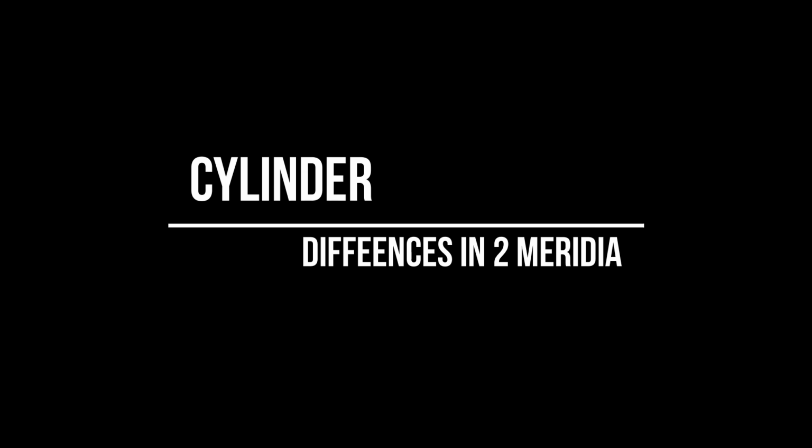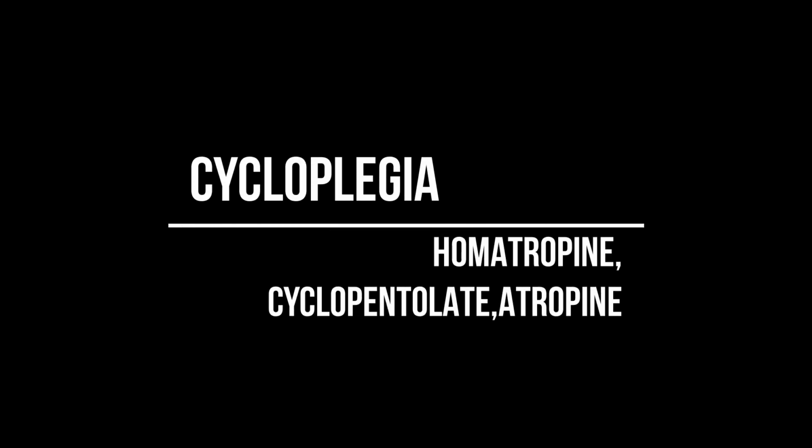Before you make your final calculation, be sure to have recorded all your findings in each meridian. For spherical correction, there is no calculation except for the working distance. Whenever there is a difference in power in two principal meridians, say for example one is +3, the other one is -2, it means there is a cylindrical correction. As you do your calculations, remember to deduct for the cycloplegia. For example, if you used atropine, deduct 1 diopter. If you used homatropine, deduct 0.5 diopters. And if you used cyclopentolate, remember to deduct 0.75 diopters.